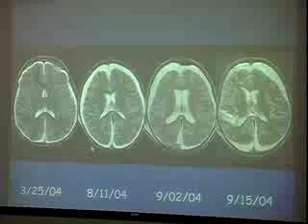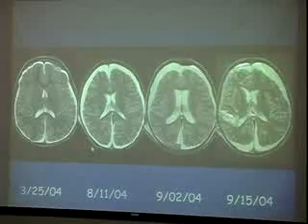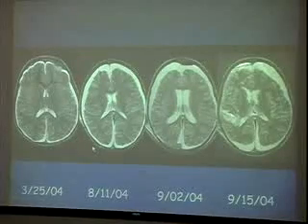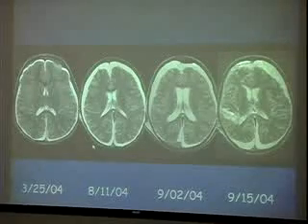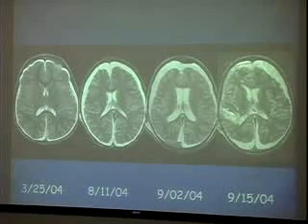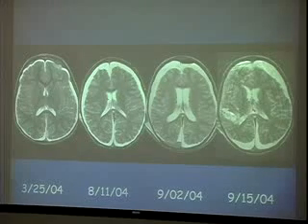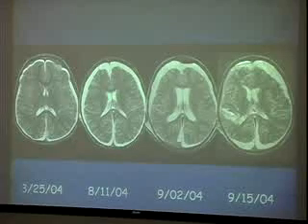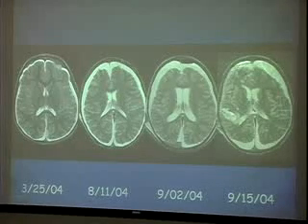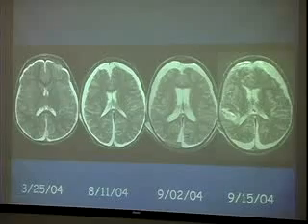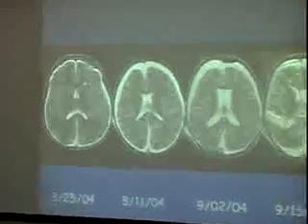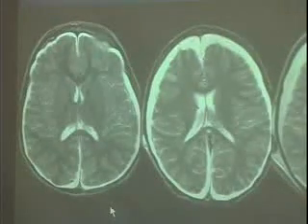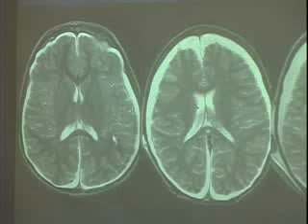I'd like to focus on the case we had here and the multiple imaging studies we obtained. We have multiple MRIs starting from March when the child first presented to September, just before the child passed away. This gives us a good picture of the progression of brain involvement, what areas were affected first, and how the disease progressed. These are T2-weighted images, where fluid appears bright. One of the first things the child presented with was subdural collections.